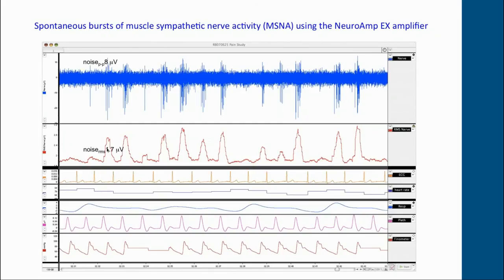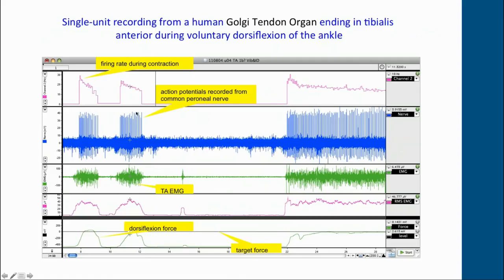The conclusion is that it's a very low-noise amplifier. This is an oligo-unitary recording — you can see the firing of individual sympathetic axons and groups of axons firing with clear cardiac rhythmicity. Using the amplifier we can also record from myelinated axons, which generate positive-going spikes, unlike the negative-going spikes of the sympathetic axons.